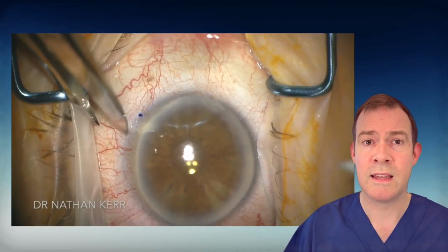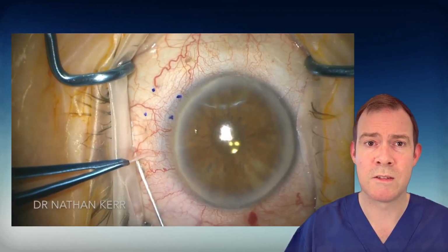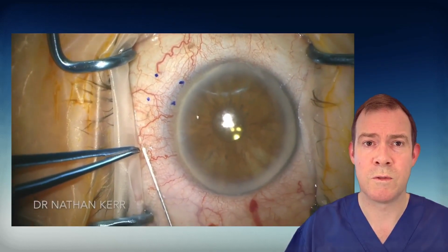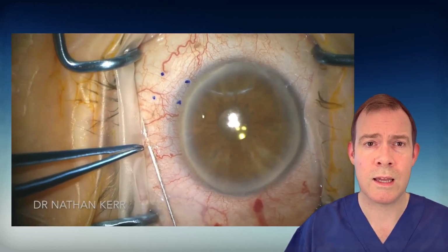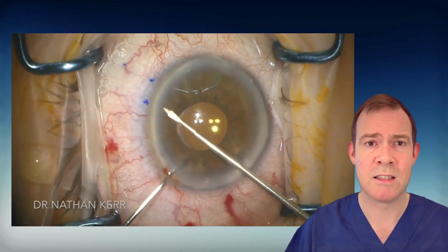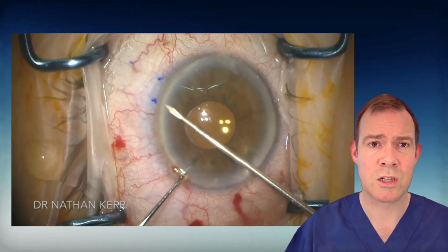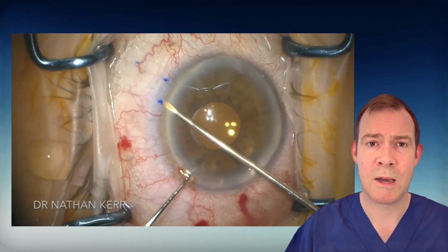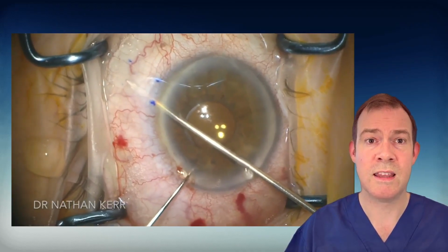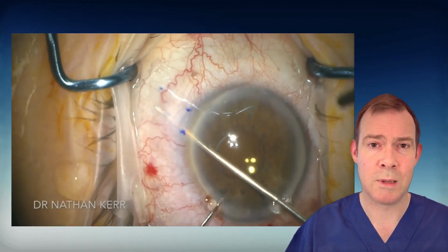Here I'm performing the air XEN technique popularized by Dr. Ahmed. Again, having marked 3 millimeters from the limbus, I'm using a 30 gauge needle connected to a syringe with filtered air, injecting quite quickly and rapidly to dissect that plane, and then to maintain that space, injecting a cohesive viscoelastic. This nicely elevates the conjunctiva off the globe, giving a large space into which the XEN can be injected. The XEN is then performed, and then the antimetabolite is injected posteriorly behind the bleb.